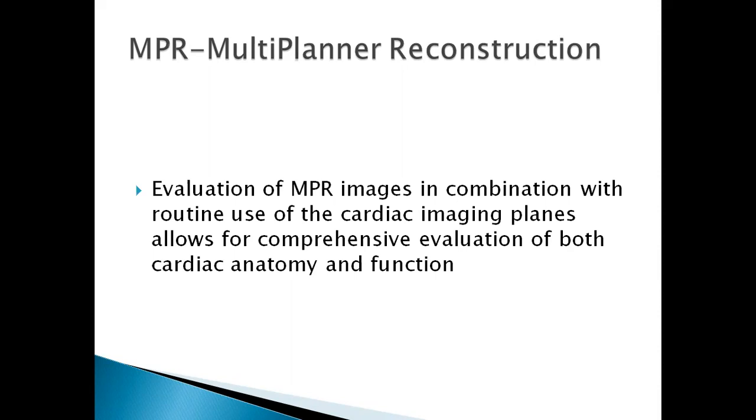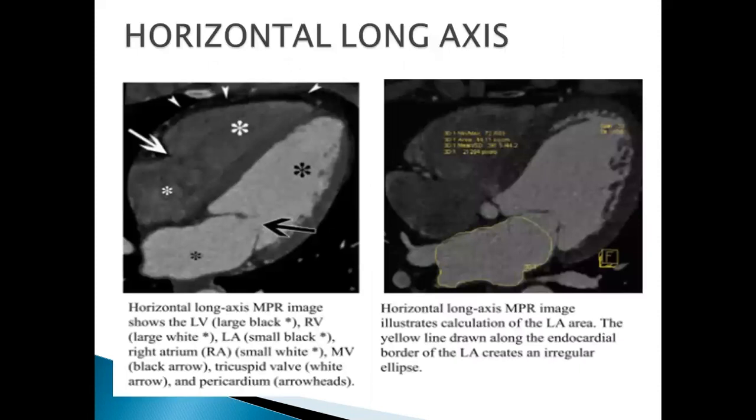Evaluation of MPR images in combination with the routine use of cardiac imaging planes now will allow you for comprehensive evaluation of both the cardiac anatomy and the function. Let's get right to the images just to drive the point home. So if you see these images, the image is from Google.